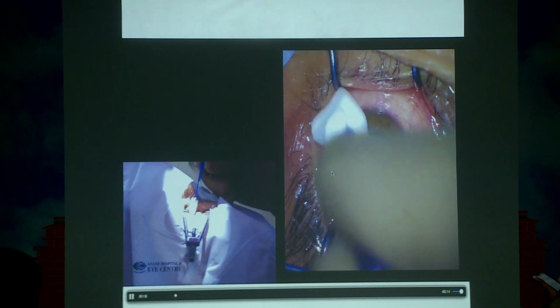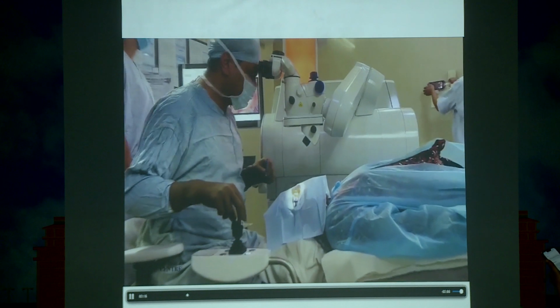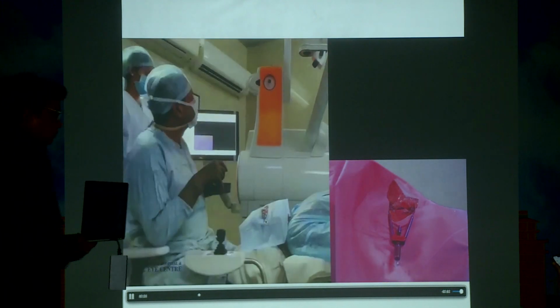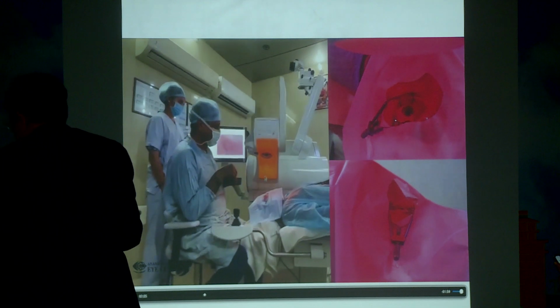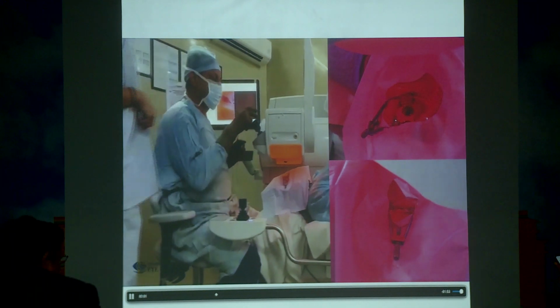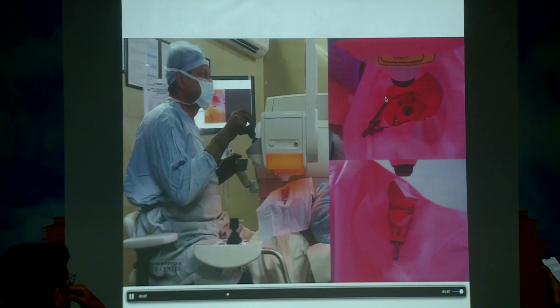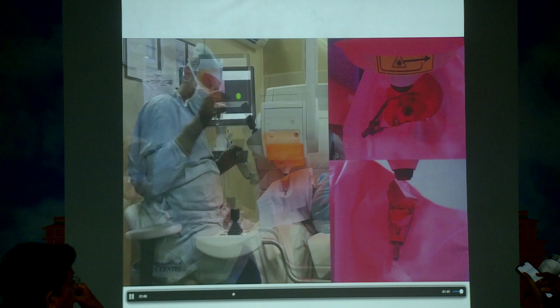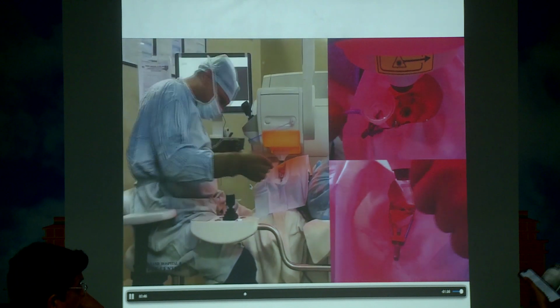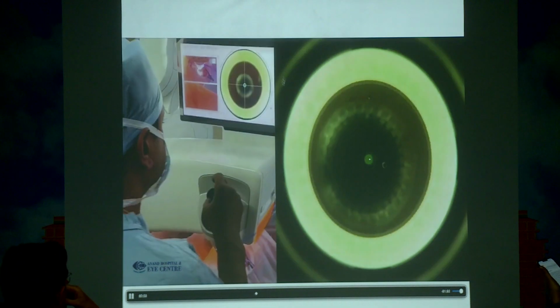This is the visual once the patient has been painted, draped and the speculum applied. This is the joystick of the bed, which is hardly taken into consideration. I'm seeing through the microscope, adjusted. Then you press the laser microscope, which swirls down, and this is the joystick here. The moment you start moving, the laser component moves down, and you see the cameras on the side. This is the interface, and it's magnetic. The moment you touch, it gets hooked on, and then you have the screen.